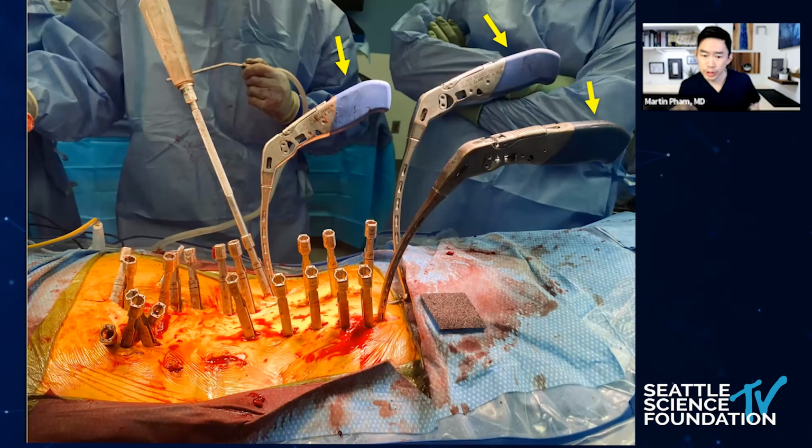So there's 3 rod holders coming in here. The 2 people in the background are my PGY7 and my PGY2. And I kid you not, passing these rods took about 10 minutes, right? And it's because all of the screws are already lined up. So as long as you know how to slide that rod and give it a little bit of grease, right? It'll go from screw to screw to screw to screw, and it'll just slide all the way down. The hardest part really is just getting through the soft tissue, but finding those screws is not that hard, especially when all of the rods are lined up.